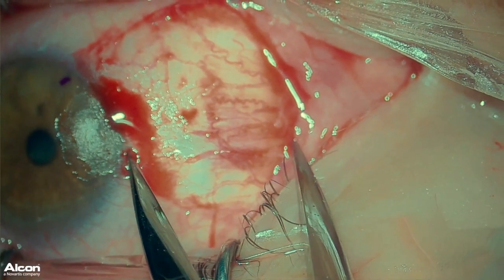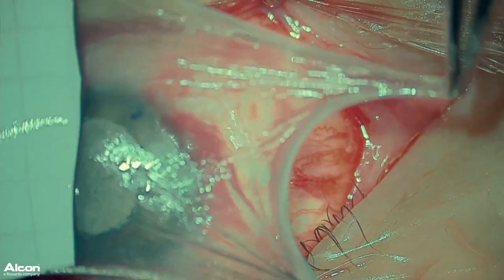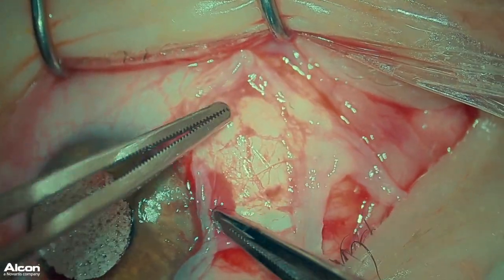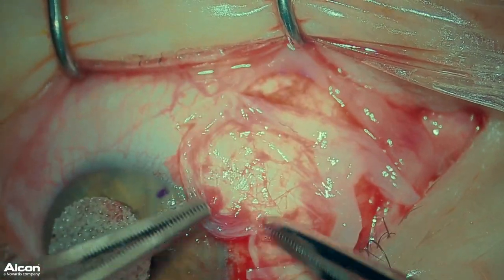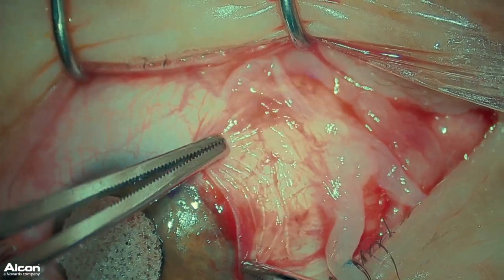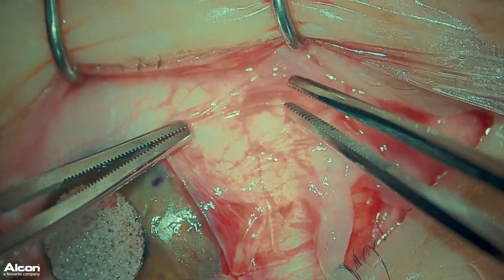I then use calipers to measure the area of bare sclera to prepare my grafts. I bring the amniotic membrane over into position. You want the sticky side, or the stromal side, down and the epithelial side up. I smooth it into position and ensure that it fits in this area. You can excise any excess of the amniotic graft.